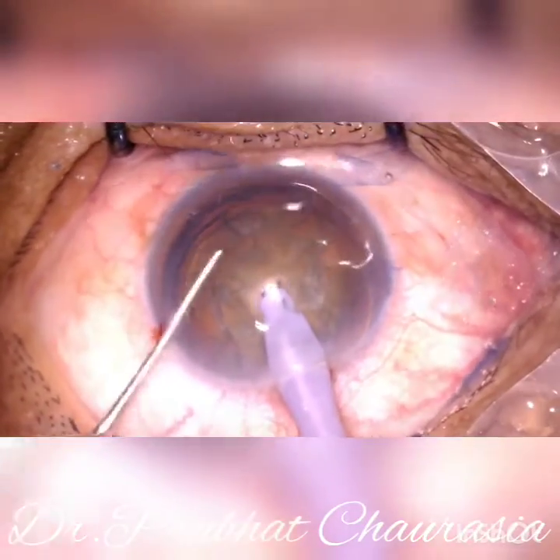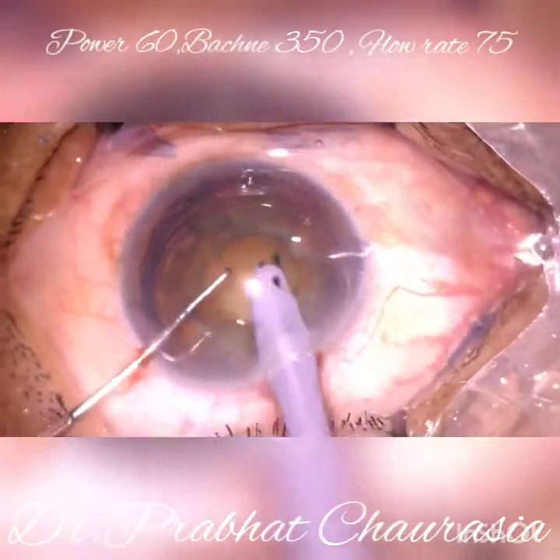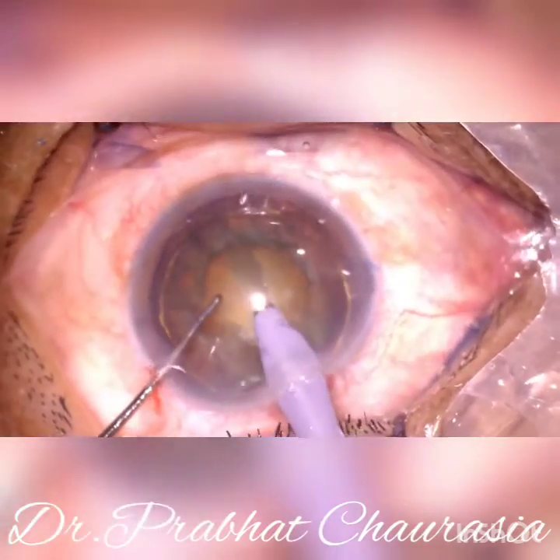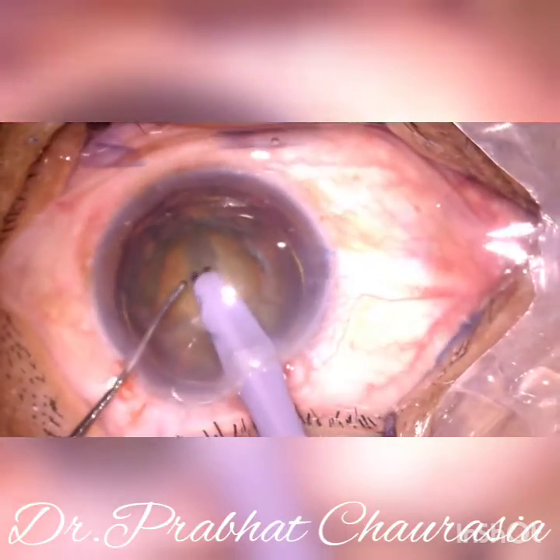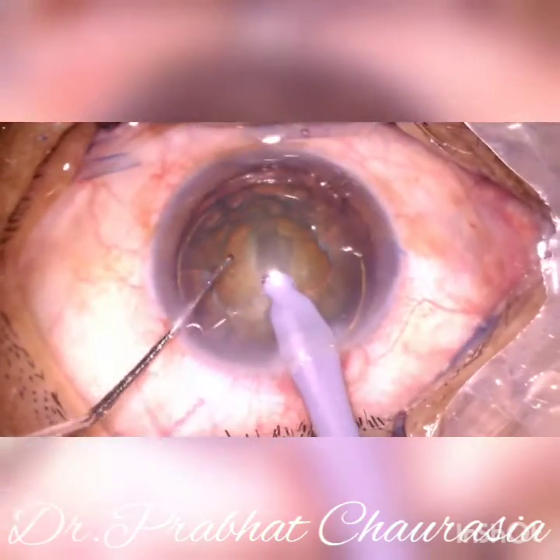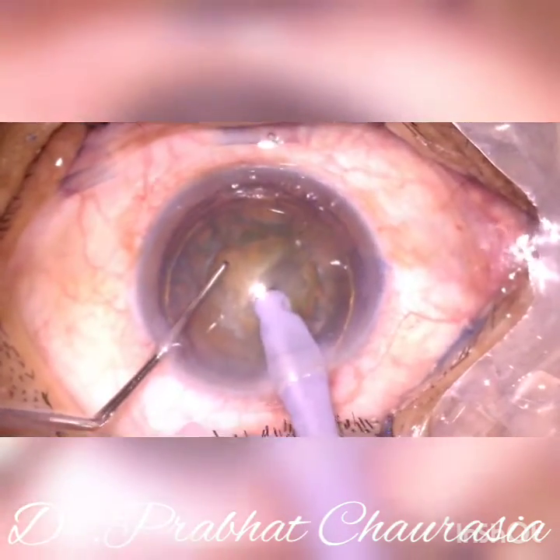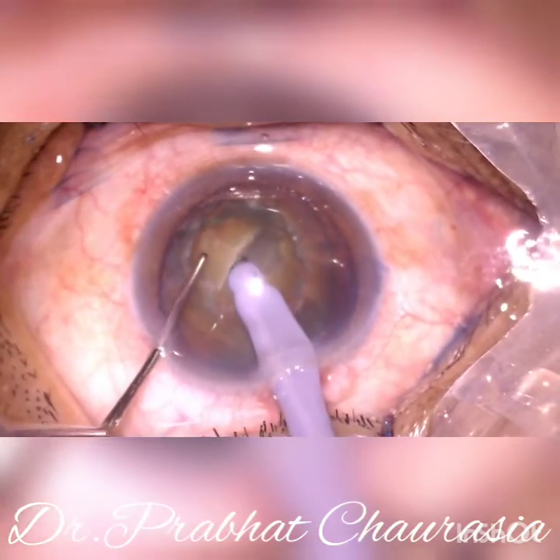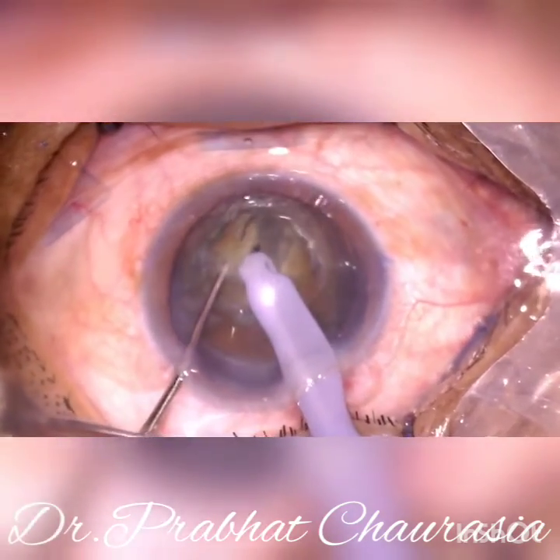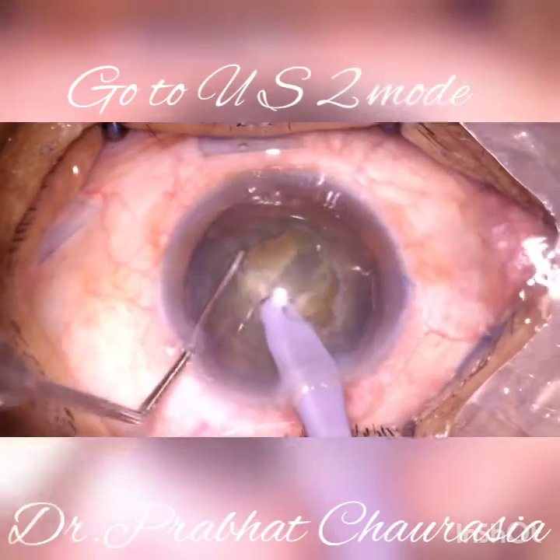First, make the trench after emulsifying the superficial cortex in US1 mode. After making the trench, rotate the nucleus about 45 degrees and embed the phaco tip in the nucleus and go to US2 mode. Hold the nucleus and then chop it — this nucleus is harder. Now rotate again.